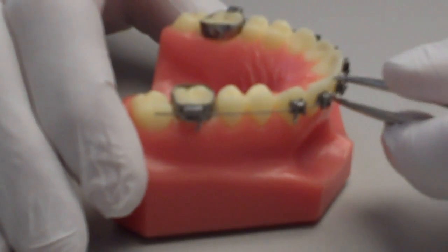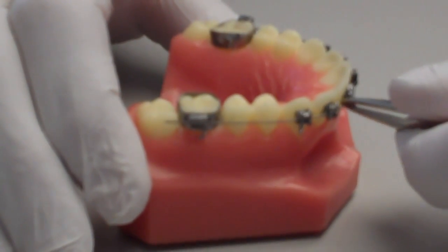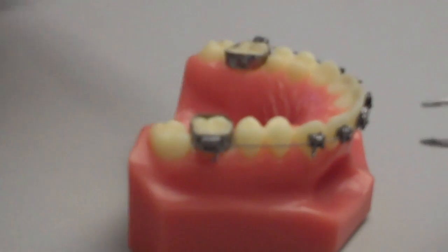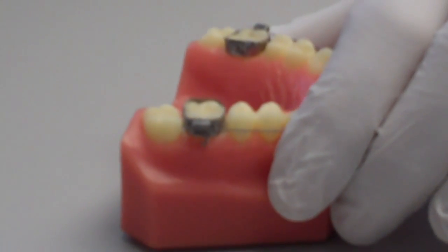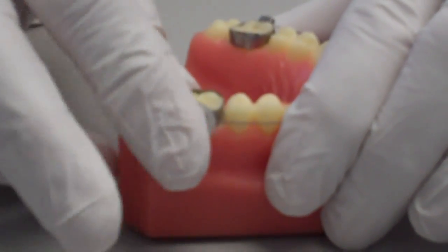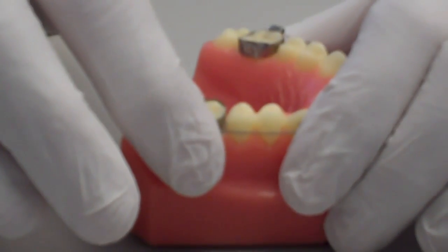Now let me demonstrate that one time again. There it is sticking out the back. You grab the wire in the front and slowly scoot the wire over to the other side. If that does not solve the problem, of course, the solution, as it is on most occasions, would be to place a big ball of wax in the area. By placing the ball of wax, it will prevent irritation of the cheeks and gums from the wire.